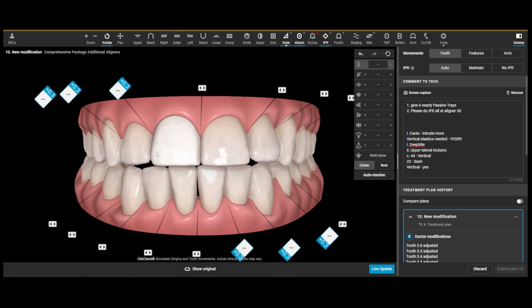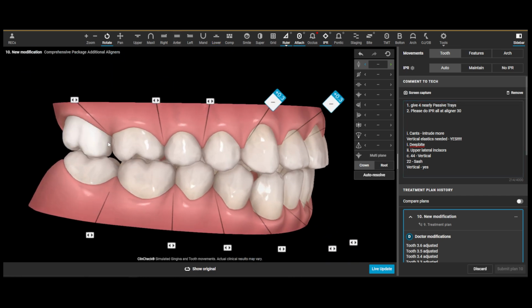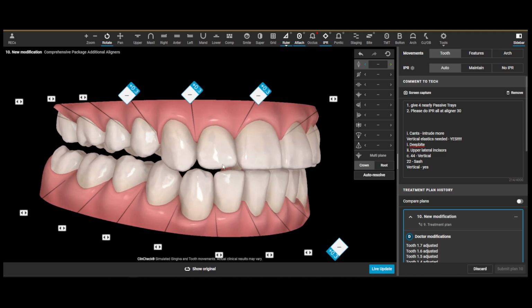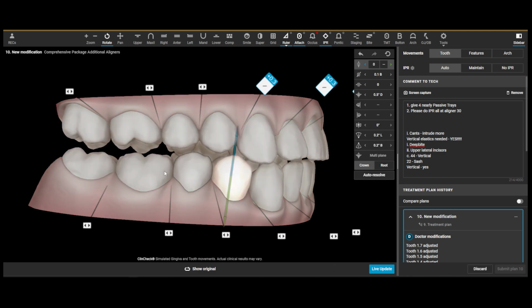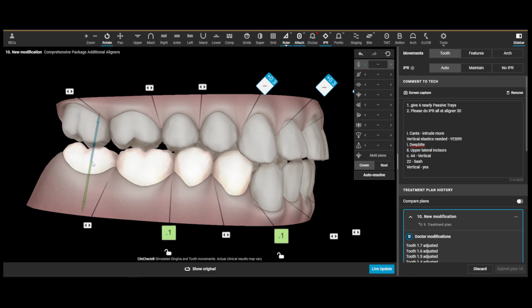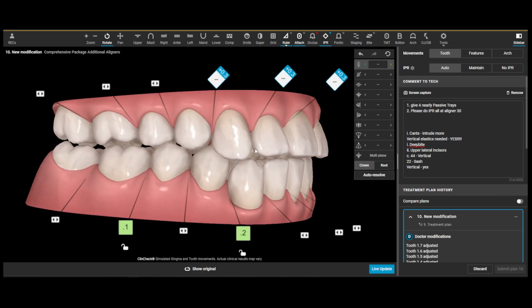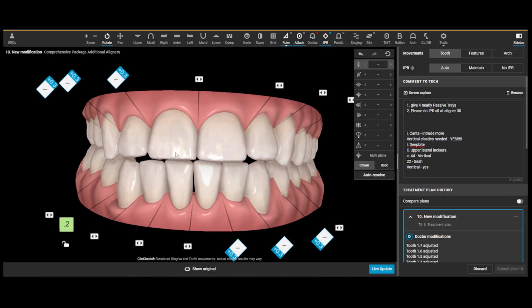The cants, well, if I want to go in here and I want to intrude these teeth even more, I can go ahead and select them all. And here's a little tip, how you can click multiple teeth as you hold down the control button. So I'm holding down control and that lets me select multiple teeth. And I could do something like this. I can grab all of these teeth and just intrude them more. Cool. If I want to intrude the lowers, grab these teeth and intrude them again, or extrude them. Now please know again that this is not occurring because we are intruding those teeth with aligners. It's not going to happen. It's from the TADs.